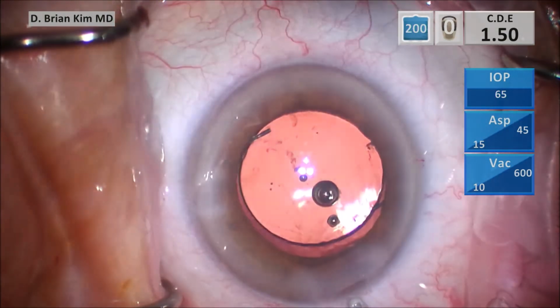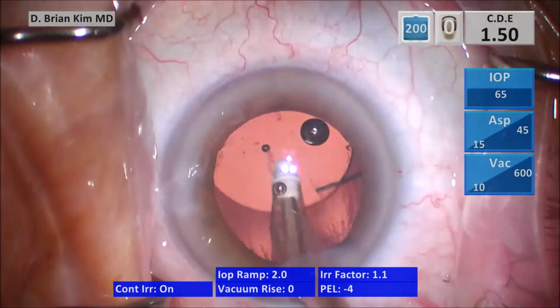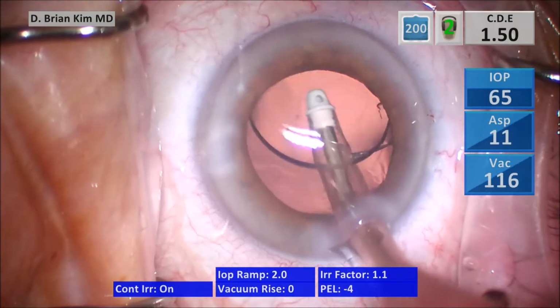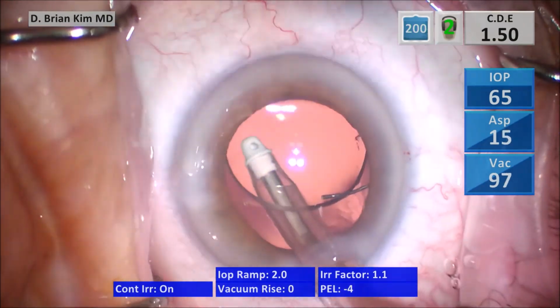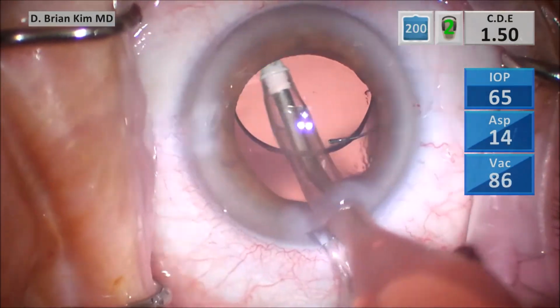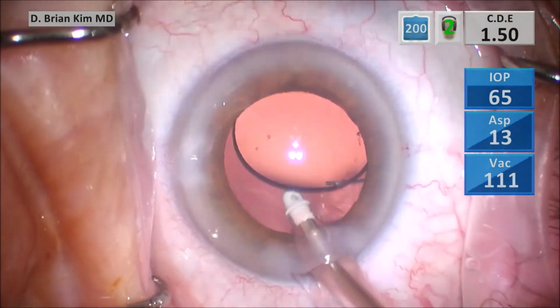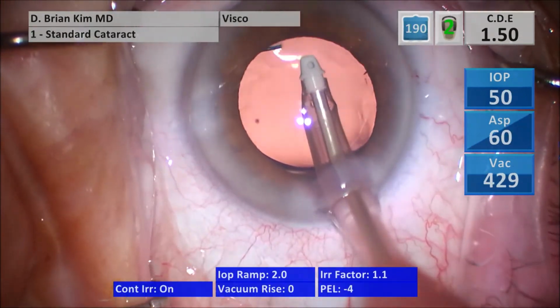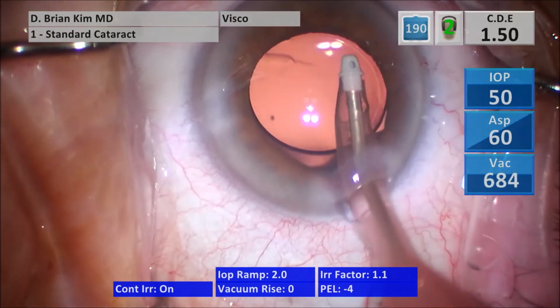So I go in with irrigation off, activate irrigation, go under the lens, removing the viscoelastic from within the bag, remove the viscoelastic from within the anterior chamber, and then I'll hydrate my incisions. So again, this is a pretty dense lens. I was able to use systematic lens disassembly using mechanical fracturing, double chop, cross chop.